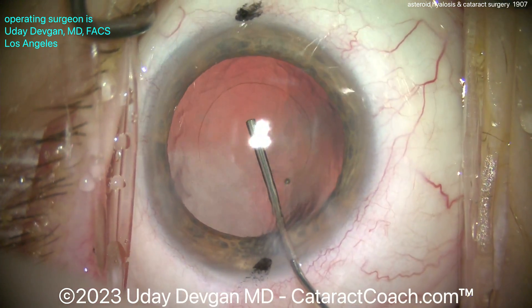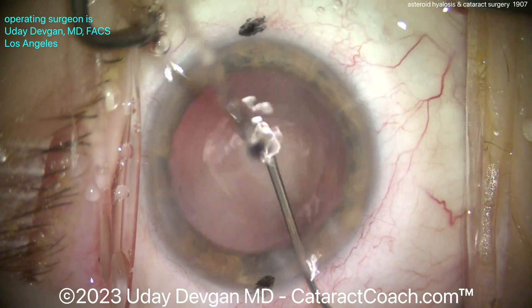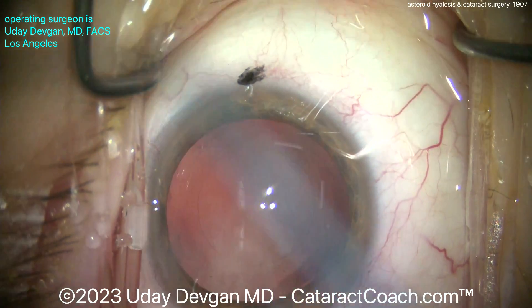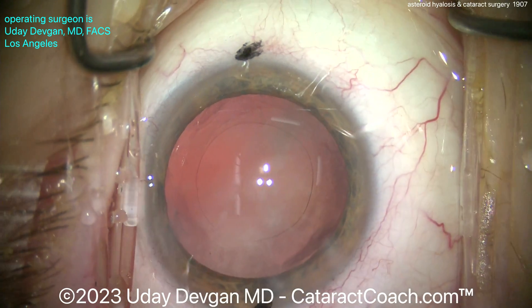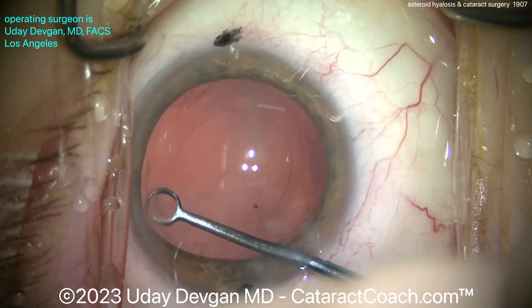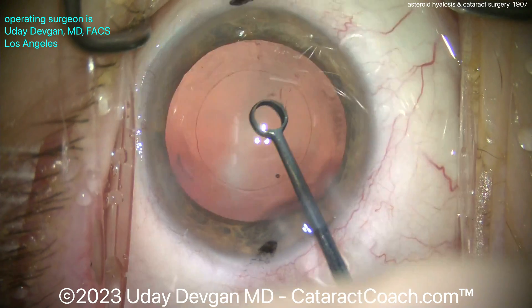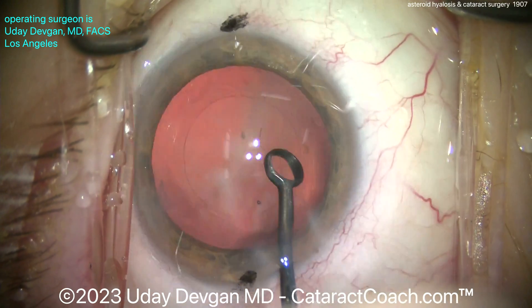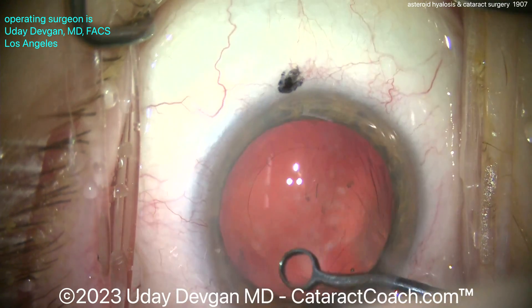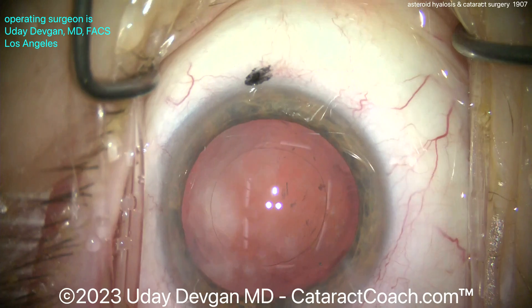In this case, we've got a pretty good view of the retina, so there's no issue there. If you don't have a good view, it can preclude your assessment. A lot of times people will do fundus fluorescein angiography to help light the eye from the inside and detect the presence of disease like vascular conditions such as proliferative diabetic retinopathy. In this case, the patient does not have diabetes.